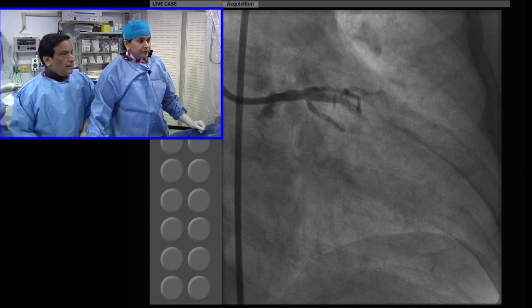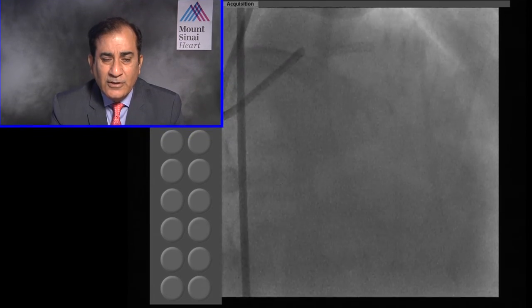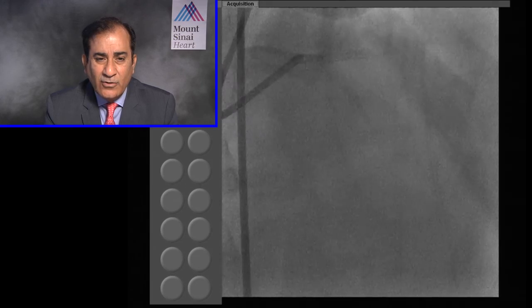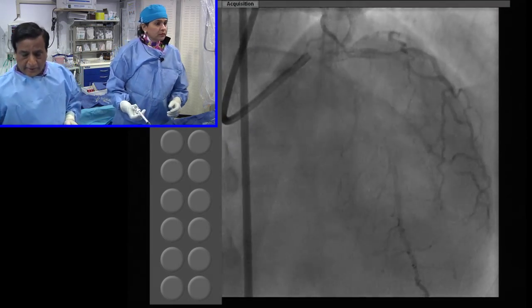Samin, from last time's questions, there were several pieces of feedback. One of the most pertinent is that the viewers want you to explain better how the markers are located on the BVS. Good. Okay, so this is the case for today.